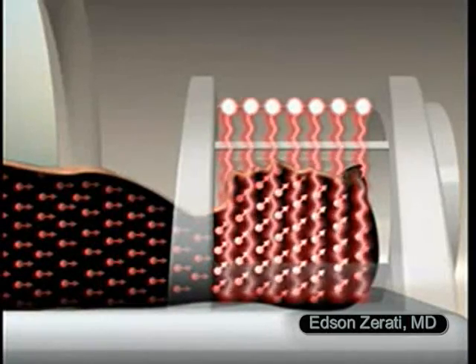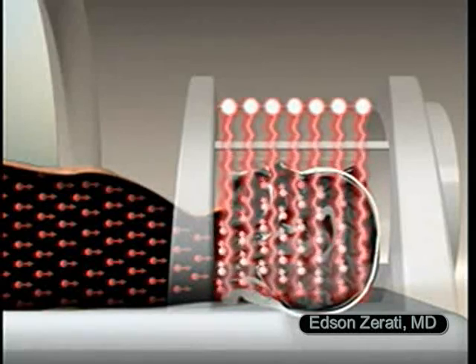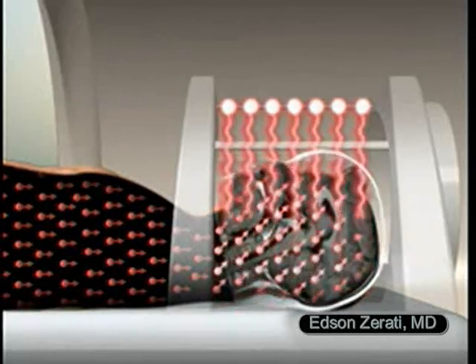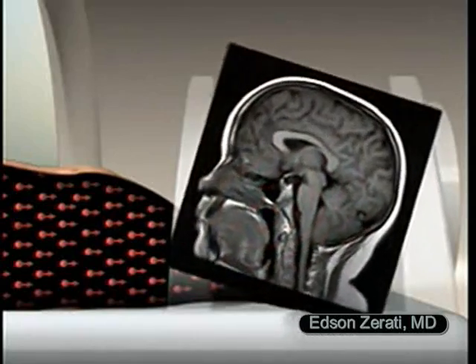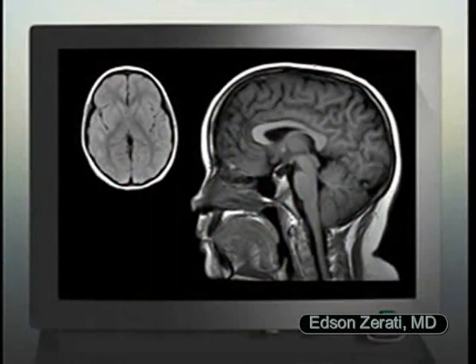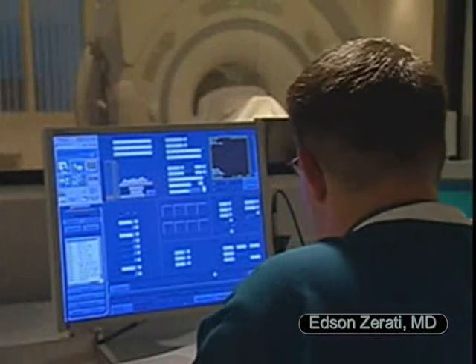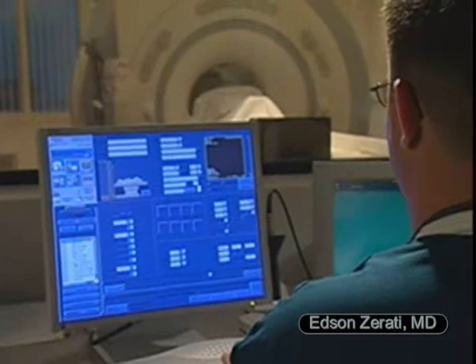An MRI exam lasts between 30 and 90 minutes. Because movement can blur the resulting images, remain still and breathe quietly without moving your head or body. Although not shown in this video, contrast agents are sometimes injected into your veins to enhance the appearance of certain tissues or blood vessels.